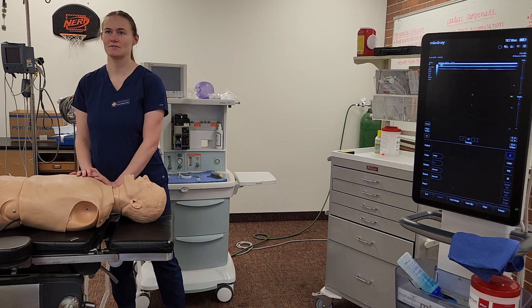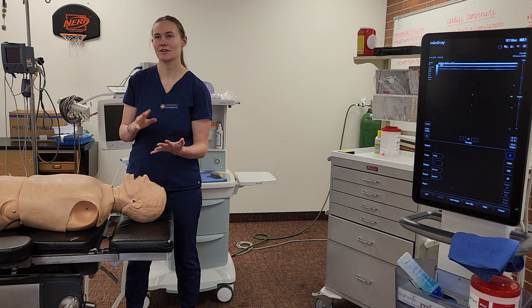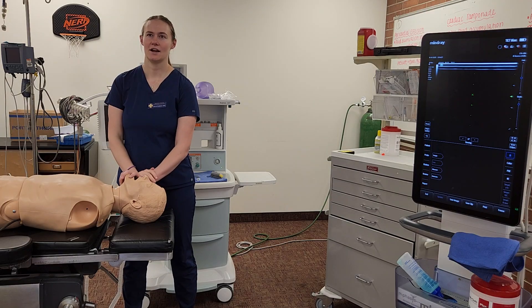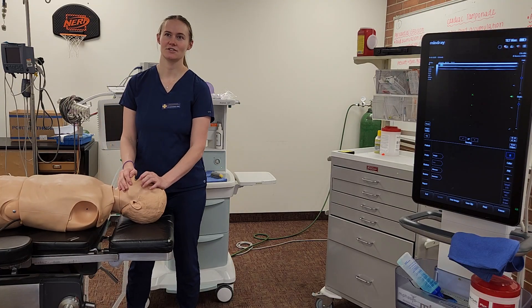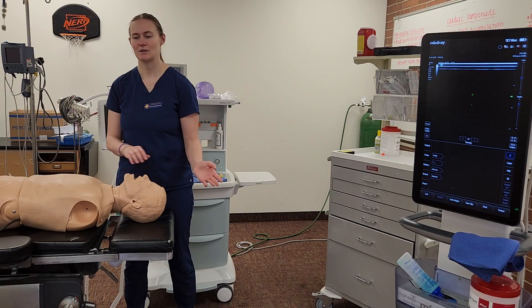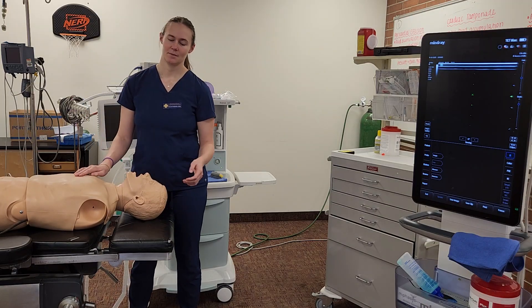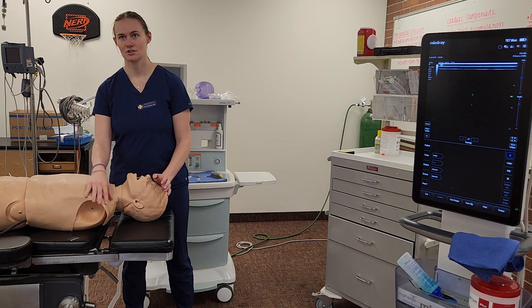Now I'll go over the block with them. This surgery is below the elbow — it's the wrist — so an axillary block is better than an ISB block. A supraclavicular block is also an option, but it's not done under general anesthesia because I need the patient to communicate if I'm poking nerves or if anything is uncomfortable. I'll go over risks, consent, and benefits and alternatives. Risks are systemic toxicity from intravascular injection, bleeding, hematoma, and nerve damage. Benefits are post-op pain control; you could make it a surgical block, but this patient doesn't want to remember anything, so we're doing general anesthesia as well. Alternatives include general anesthesia only or IV opioids. Then we get consent — the patient signs for anesthesia and the block. I'll confirm the surgical site and have the patient initial it to agree on the spot.